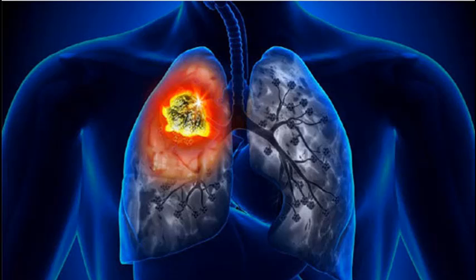So the consequence of missing 1 day, if you were off by just a little bit, contributes 20%. So that's essentially like being off, whatever degree at which you were off, 20% of the time. That has significant consequence to possible recurrence or hitting a critical organ of, say, the heart or the spine.